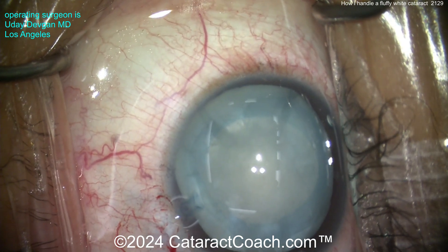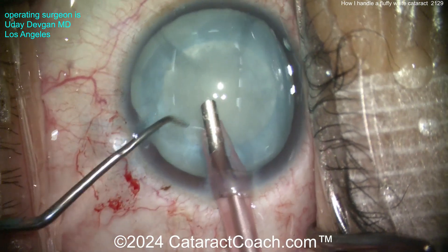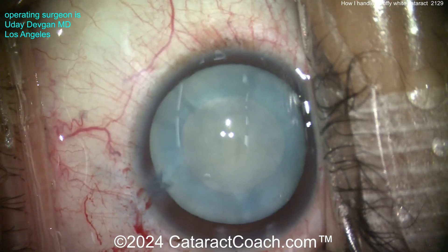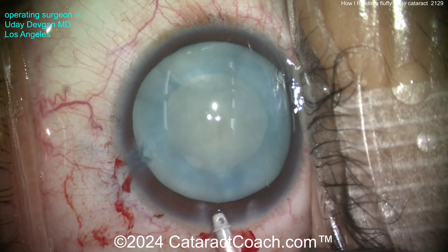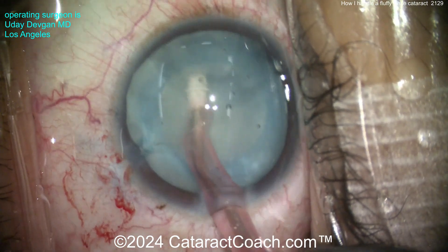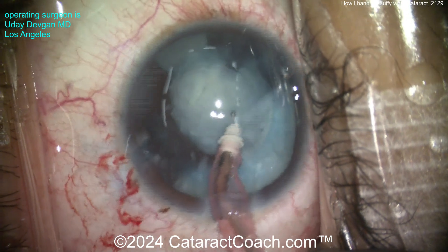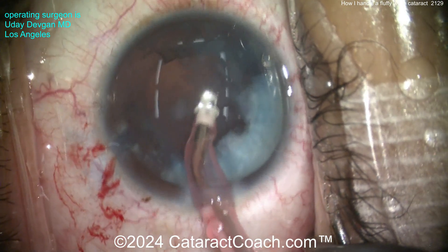Instead of putting the phaco probe in, just put in the IA probe. Here's the phaco probe — we can try it, but you'll see it's just so soft. I'll put the chopper there as a safety margin and try to vacuum. It's just not worth it — come out and go with the IA probe; it's a lot safer. So now we switch over to the IA probe with a soft polymer tip, which helps protect delicate tissues like the posterior capsule. We can just vacuum all the lens material out with the IA probe. As seen in yesterday's video 21-28, if you put a phaco probe in and give any phaco energy, you'll go right through the capsule. Here, just aspirating all this material out — it comes out very easily through that tiny port of the IA probe.